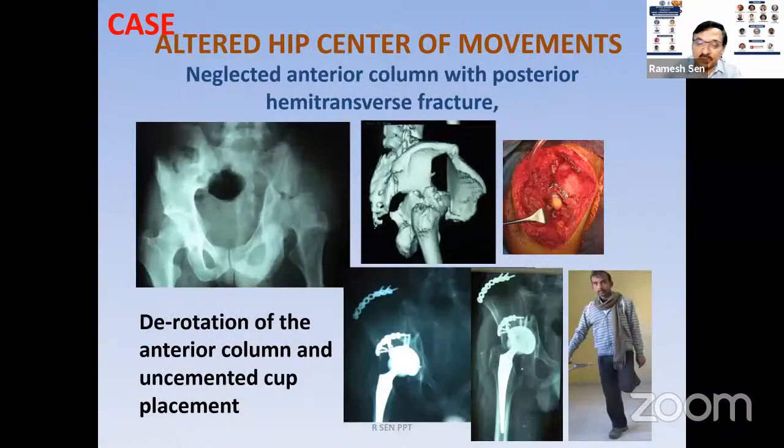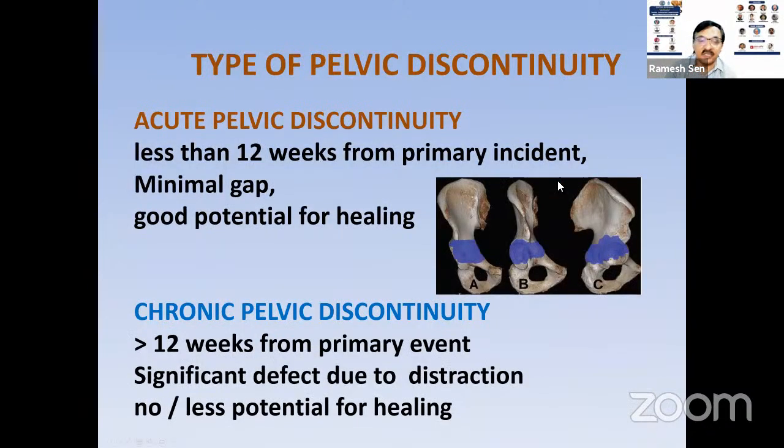Another case where there was a complete fracture of the ilium, and when he came as a neglected case, we went by that extensile iliofemoral (EIF) approach, what Dr. C.P. Das has beautifully told, and we stabilized this case, and then we did a THR in the same approach, and this is what his ability is.